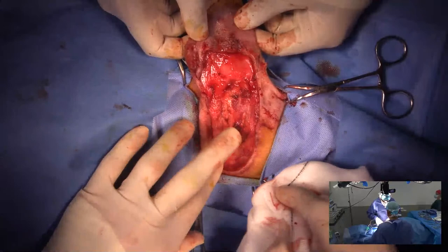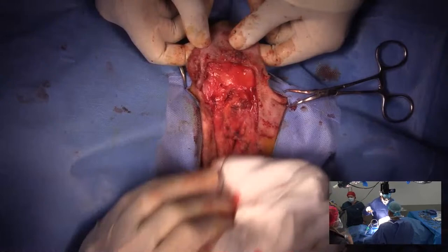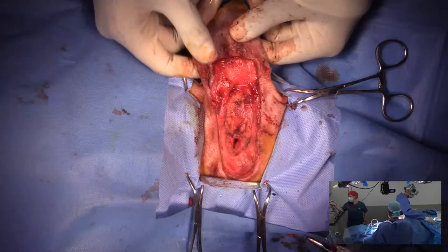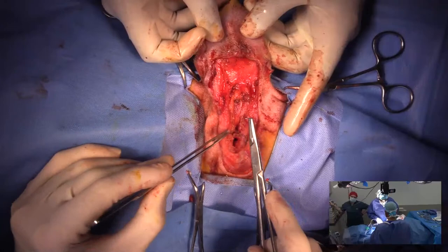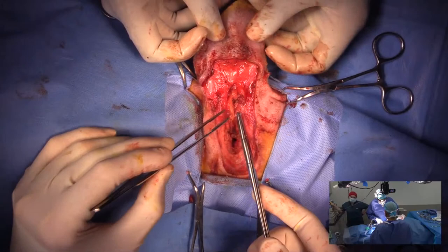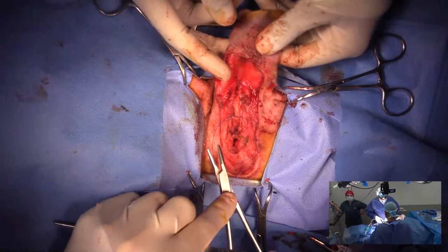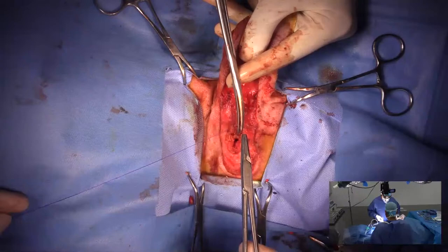Where's that bleeding coming from? Thank you. See how this is going to come together best. I have had one animal necrose its pinnas. And that was a diabetic cat, so I assume that it had a peripheral vasculopathy.